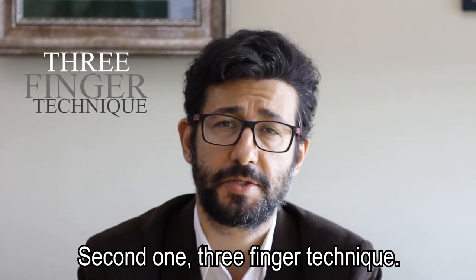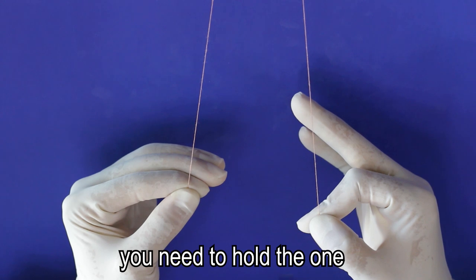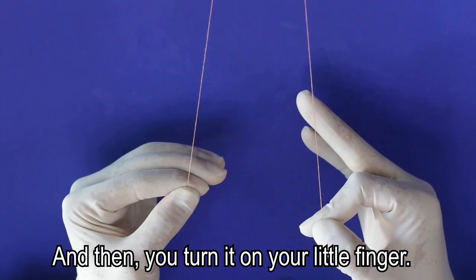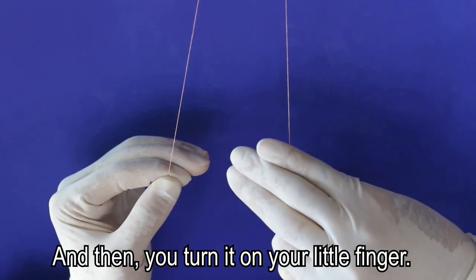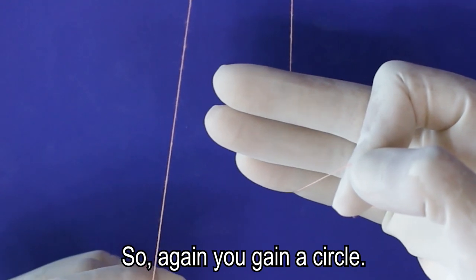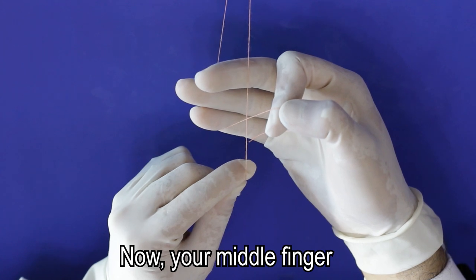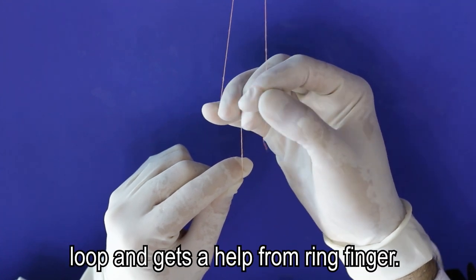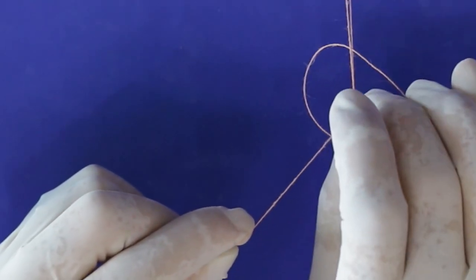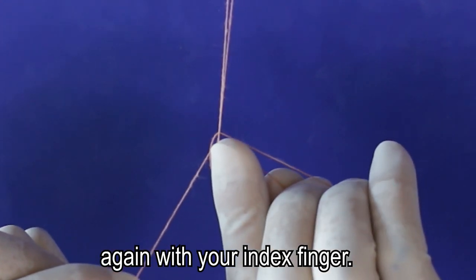Second one is the three finger technique. In this technique, you need to hold one side of your suture between your thumb and index finger, and then you turn it on your little finger. So again, you gain a circle. Now your middle finger loops and gets a half from the ring finger. Onwards, follow your knots again with your index finger.